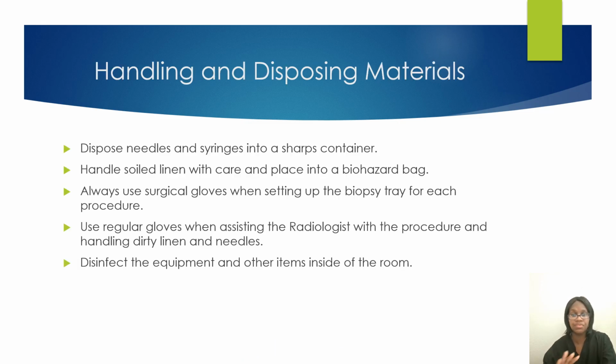Whenever you are getting rid of your sharps, make sure that no one is around. Make sure that you're not just running in and out with the needle in your hand. Always use your surgical sterile gloves whenever you are setting up the biopsy tray. You cannot use the regular gloves that are in the room because those are not sterile. Disinfect the equipment before and after the patient.